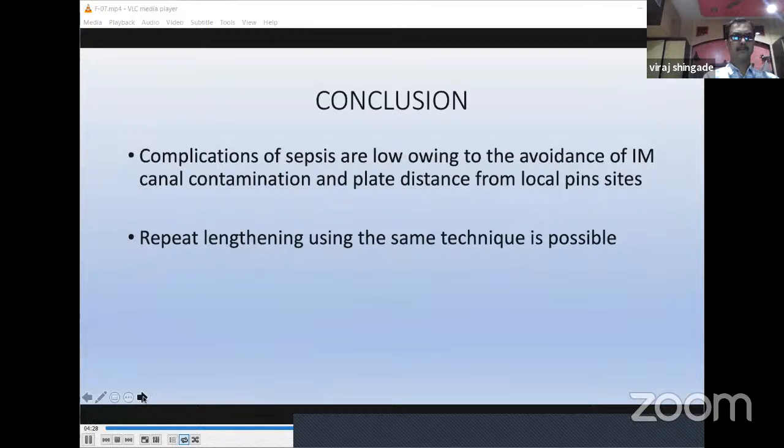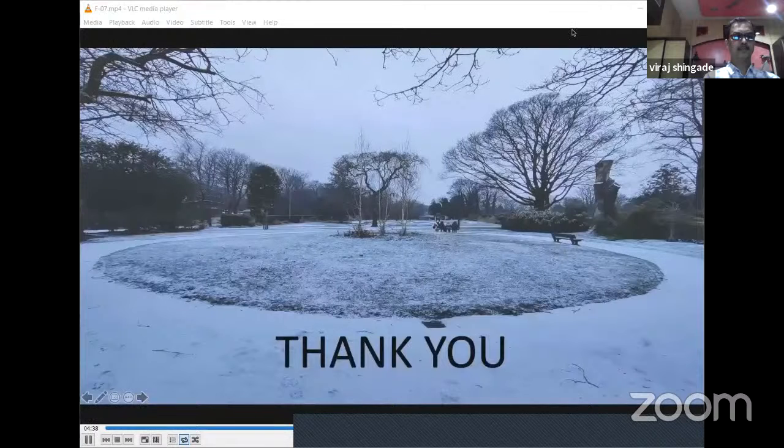Complications of sepsis are low since the plate is away from the pin site and the intramedullary canal is avoided. The same technique can be used again for repeat lengthenings on the same limb. Thank you.